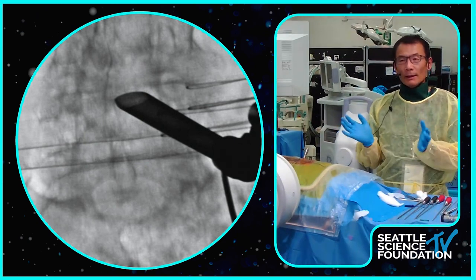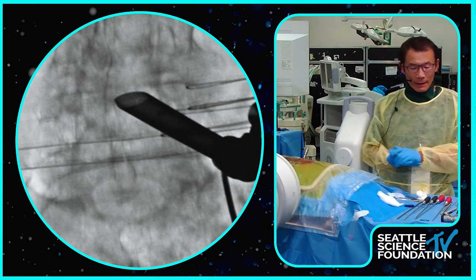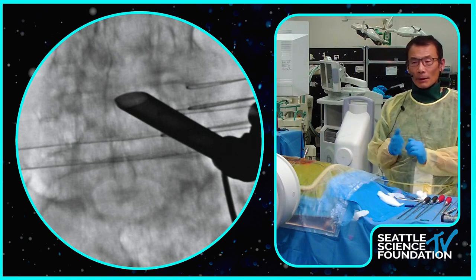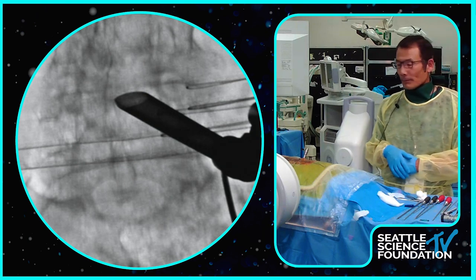You start a little bit more lateral than your regular interlaminar approach. But I start my laminotomy or facetectomy medially and work to the contralateral side and to the ipsilateral side. Work your way laterally.